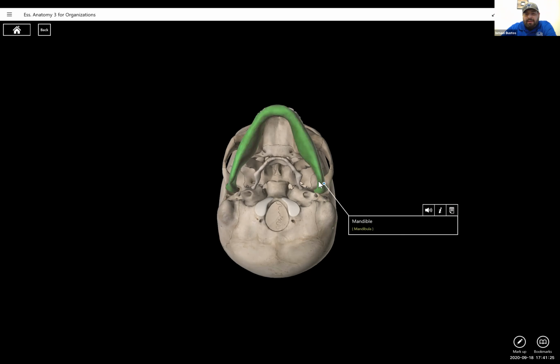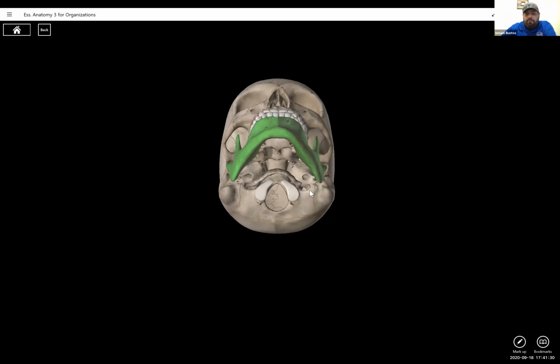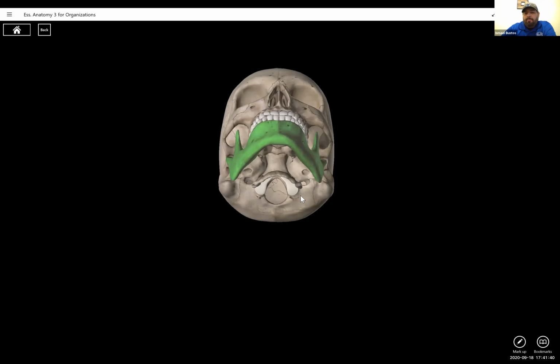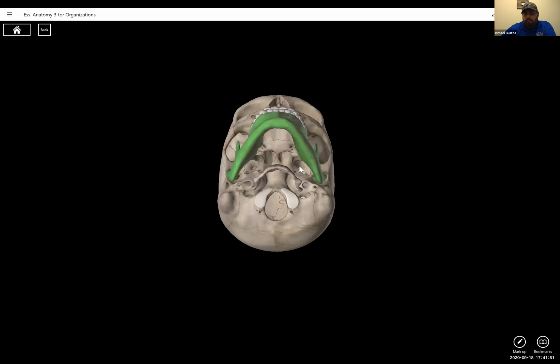So pay attention to this mandible. How is that mandible going to get superimposed over those mastoids? Well, if I don't have enough extension, because this is the proper amount of extension, you see these get cleared away from the mastoids. But if I don't have a proper amount of extension, do we have the mandible now getting superimposed over the mastoids? We sure do. And that is caused by insufficient extension.